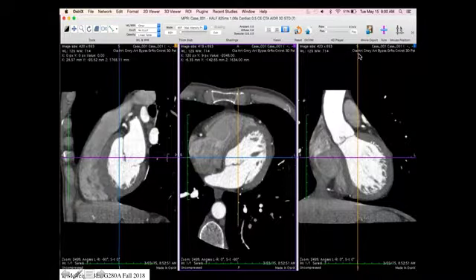If we cut this view along this line here, that's called a sagittal cut. And that's straight down the center of the patient like this, or shifted one side to the other, but vertically. And that looks like this over here.